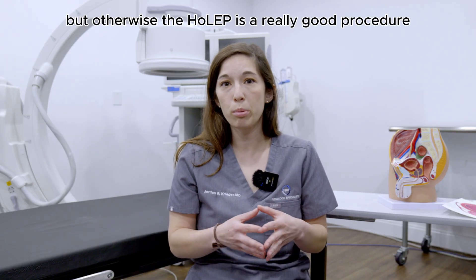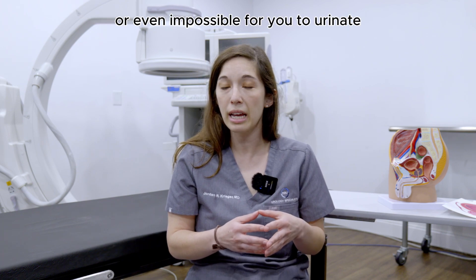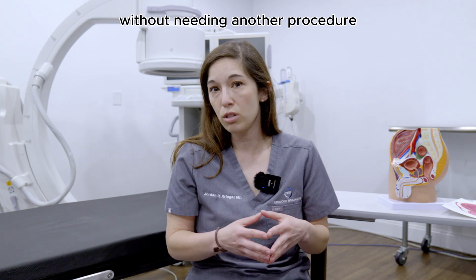The HOLEP is a really good procedure to remove all of that tissue that's making it hard or even impossible for you to urinate, without needing another procedure potentially in the future.